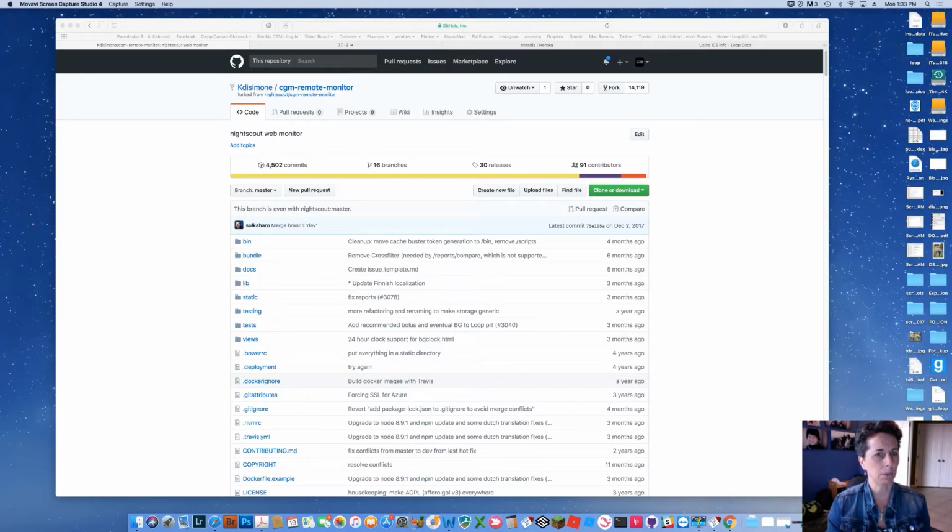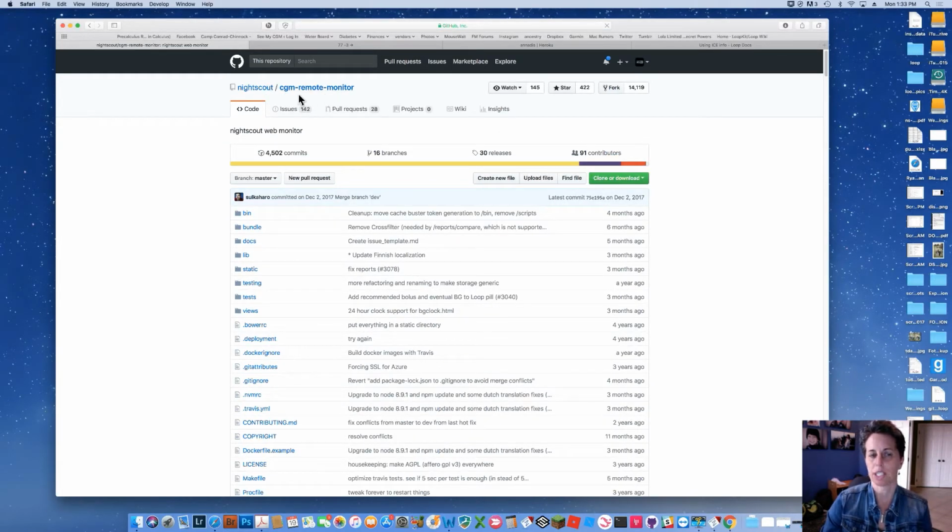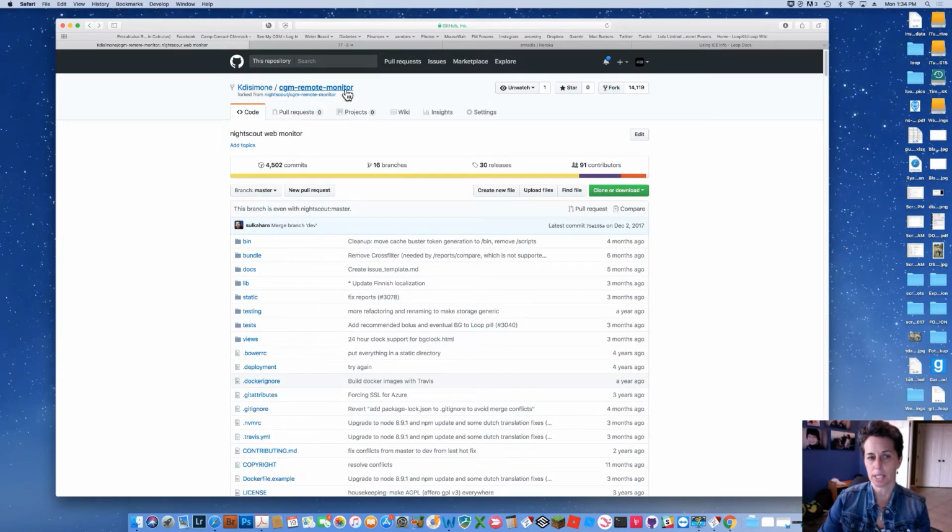This is probably something you won't end up doing, but just for the purposes of showing you what's available and how information flows, particularly for nightscout, I'm gonna do an example with CGM remote monitor and my nightscout site so you can see an example. So the way that all of us have created our nightscout site is we went to the nightscout repository, their version, nightscout CGM remote monitor, and we forked a copy into our own account. So we went to the library, we borrowed their book, we made a copy, and we put it at our home library. So we have a fork of our own, a copy in our home library, which is this.